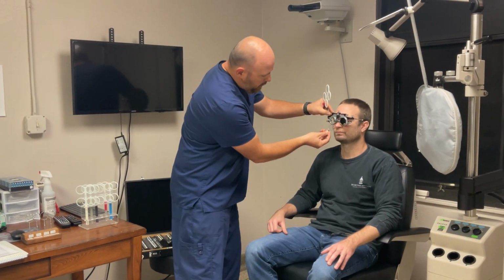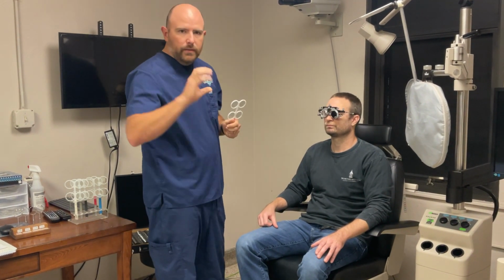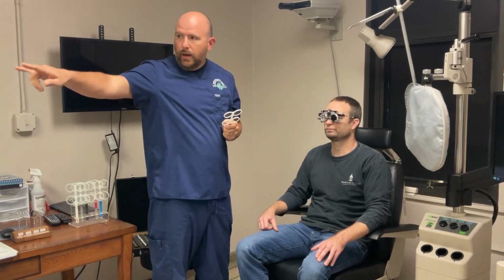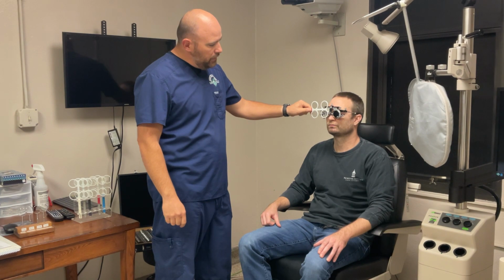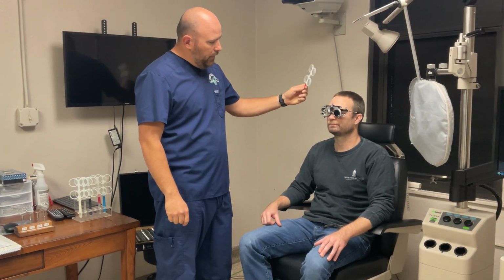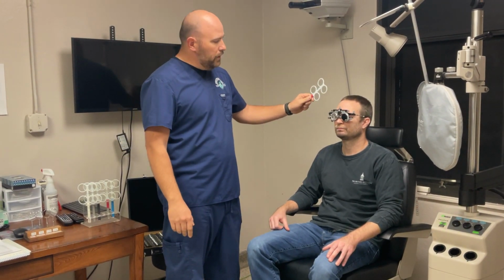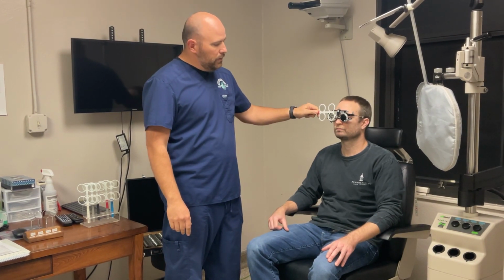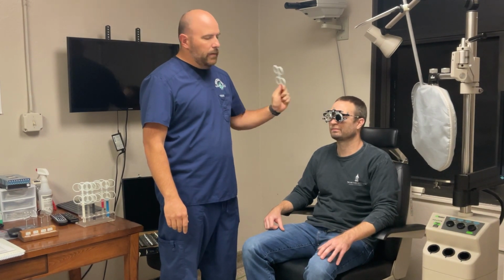Same thing, grasp the frame here and slide the lens in, being careful not to twist the frame on the patient's face. All right, so let's do it again. I'm still looking at the same letters up there, okay? Now let's go with the lens or without the lens. About the same. About the same, okay? Now, sometimes what I do in the case of a real patient is I'll just quickly check on the plus side again. And I'll say with the lens or without the lens. About the same too. About the same, okay.